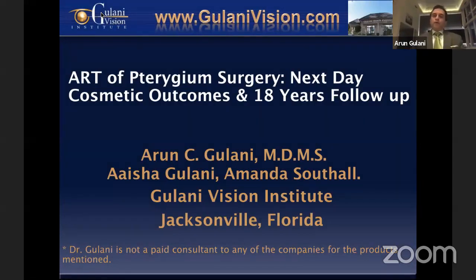Okay, lovely. So we'll start talking about pterygium. Obviously, I know a lot of you here, and I do know all of you are wonderful surgeons. My concept of teaching always takes you into concepts, which is how to plan, and outcomes, which is the most important thing we must plan, and then surgery just happens. Throughout this talk, I'm going to talk about what my desires are, what's in my mind when I'm operating. I don't want you to think about driving, I want you to think about the destination. Make the drive fun, keep the music loud, have fun in a nice car, look at the scenery. That's the concept of surgery to me.